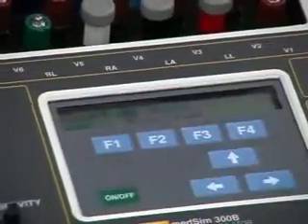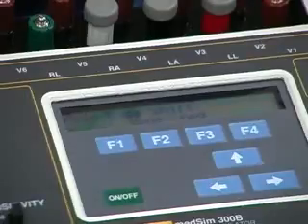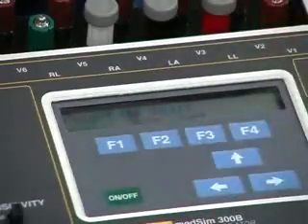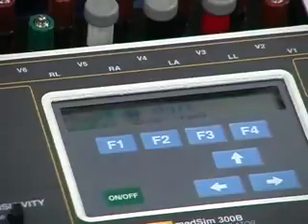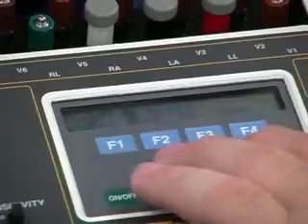And this would be a matter where, in a lot of cases, you have a baby who will, in an intensive care, critical situation, inhale and then start to pant, breathe very fast. Or they can exhale and breathe very fast. Well, we simulate that with this. It's a baseline shift where you do the increase and then you go to a fast rate, or you exhale and go to a fast rate. So you can see how well the monitor can respond to those changes in the signals, especially for neonatal applications.